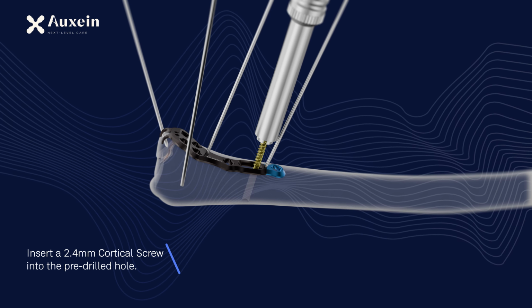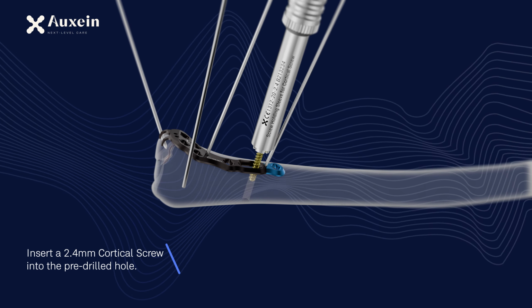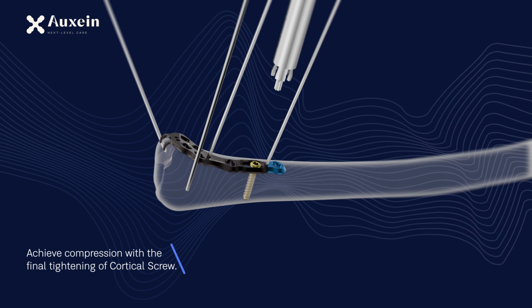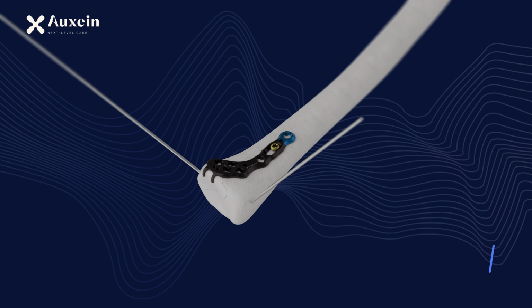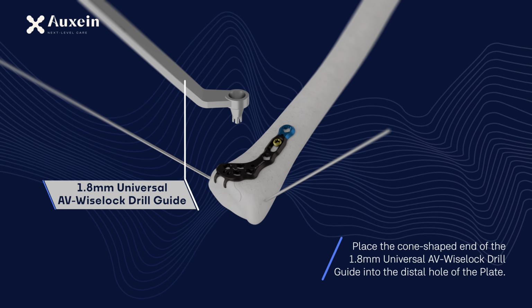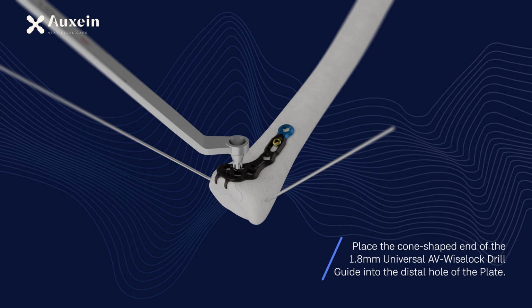Insert a 2.4mm cortical screw into the pre-drilled hole. Achieve compression with the final tightening of cortical screw. Place the cone-shaped end of the 1.8mm universal AV-Wiselock drill guide into the distal hole of the plate.